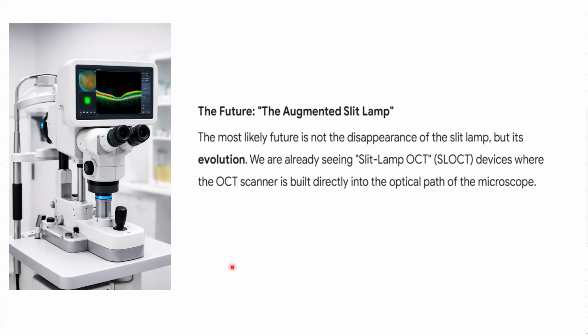Another thing is the stereoscopic real-life visualization. You are seeing your patient stereoscopically, in three dimensions, which is not the case on the OCT. So most of the experts think that the future will not be that we neglect or forget the slit lamp, because it will remain the gold standard for any basic eye examination.